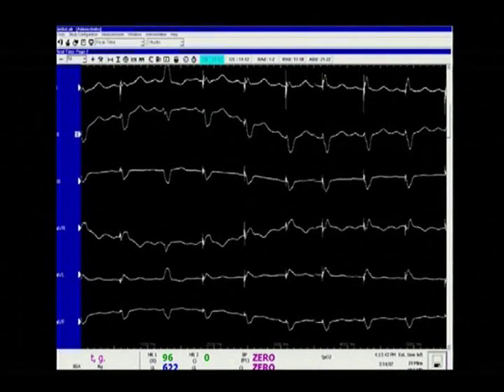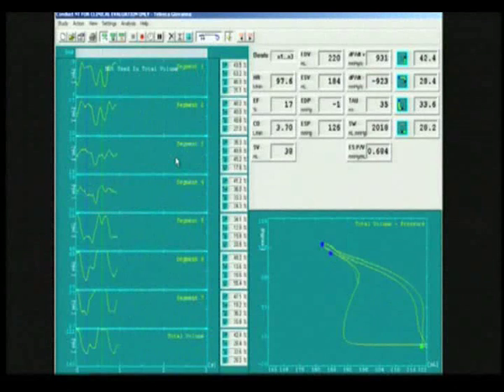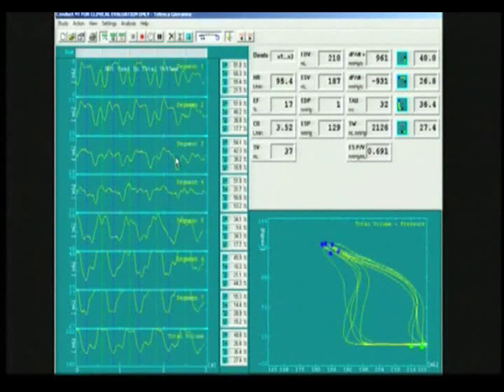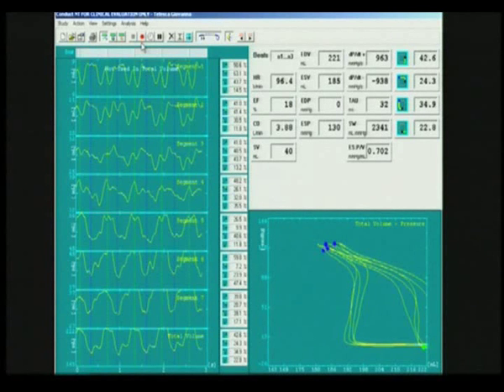Once we reach the desired position with the lead and after assessing the sensing and pacing thresholds, we evaluate the PV loops from this site. As you can see, there is a clear difference compared to the previously stimulated sites. There is still marked dyssynchrony between the 7 sequential segments of the left ventricle, associated with a rightward shift of the PV loop, indicating a worsening of cardiac function — not justifying placing the lead in this site.